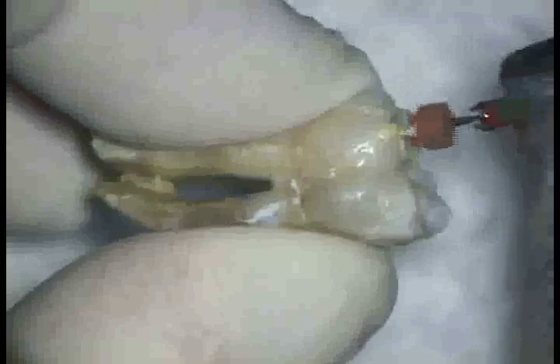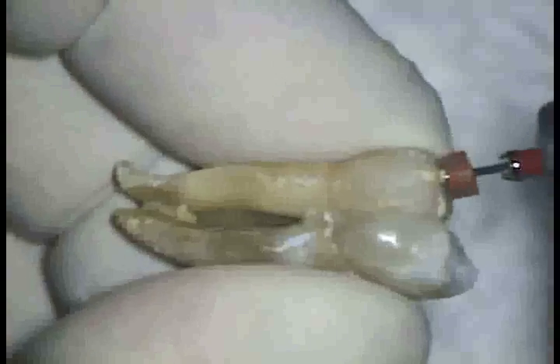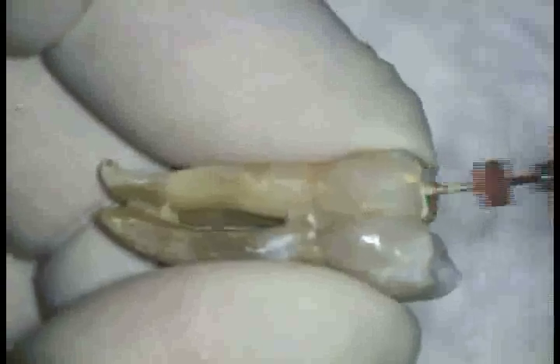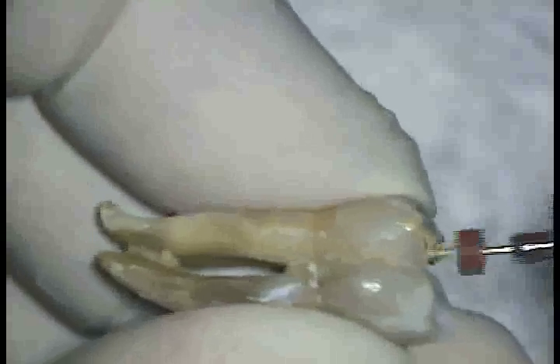This step is done twice. Note that despite the vigorous pumping of cement, no cement is driven over the apex with the applicator. The master point is then liberally coated with cement and placed into the canal.